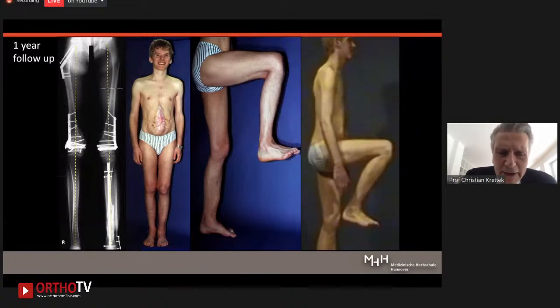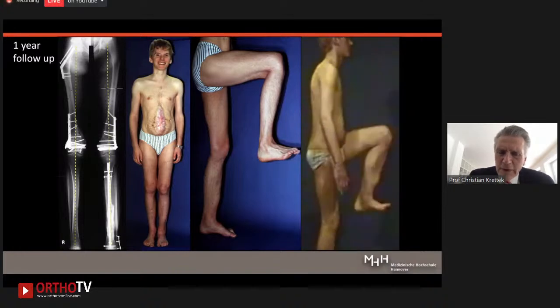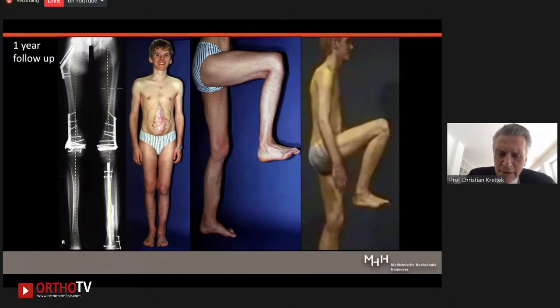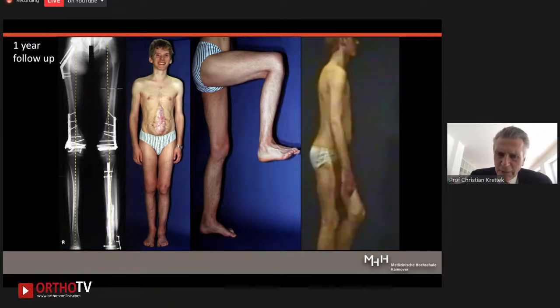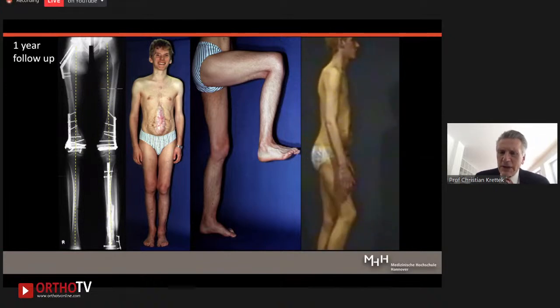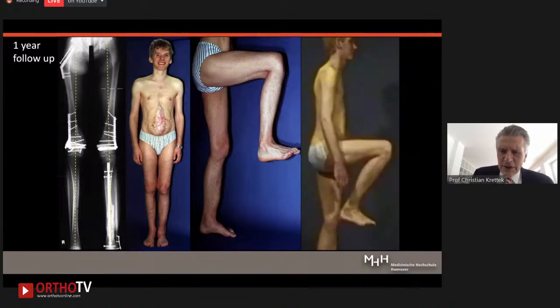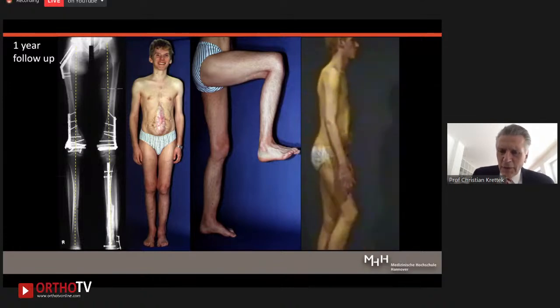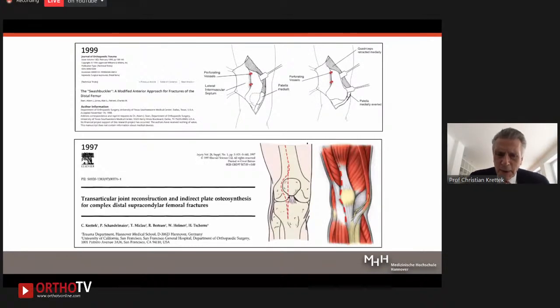Here, the bilateral fractures, so the other side was fixed with minimal invasive techniques, but with a different approach as well. Good alignment, good leg lengths, good range of motion in this patient who had other severe injuries, as you can see from the X-ray. This has been published in a couple of journals.